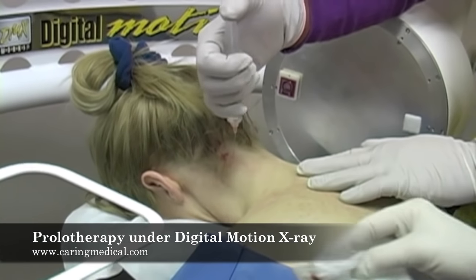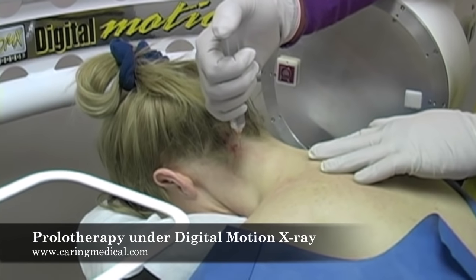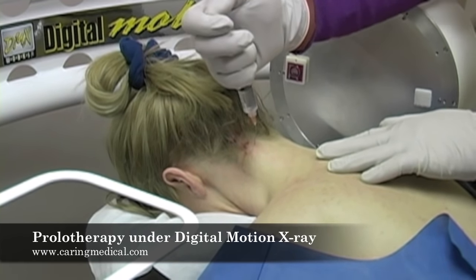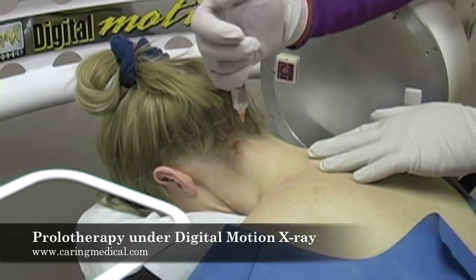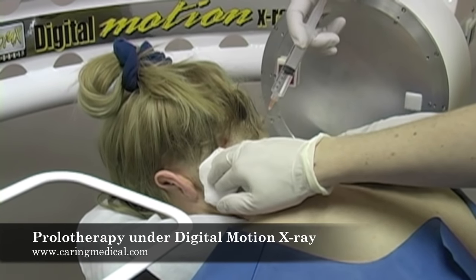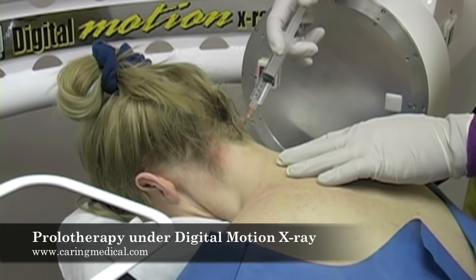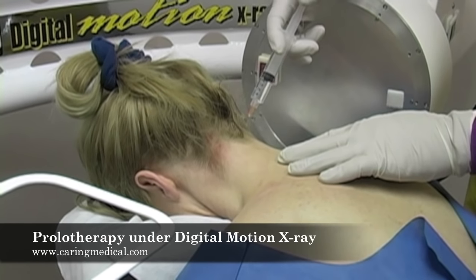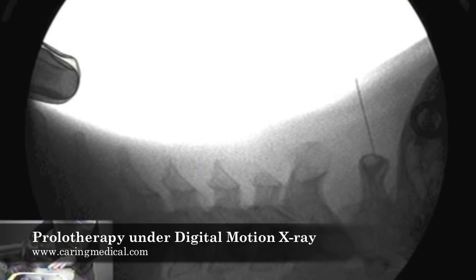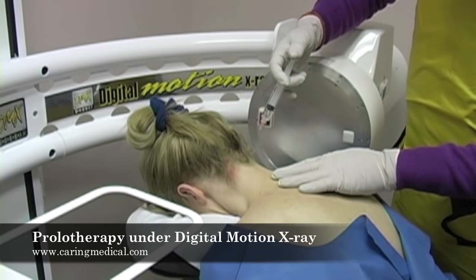That last x-ray clip was on C1, so you can see that you can easily and safely do C1 under fluoroscopy — especially in those cases where you believe the person has C1 or C2 instability. Anyone who has really severe suboccipital or migraine headaches, as well as patients who have vertigo or tinnitus — ringing in the ears — could possibly be experiencing symptoms from C1 instability.